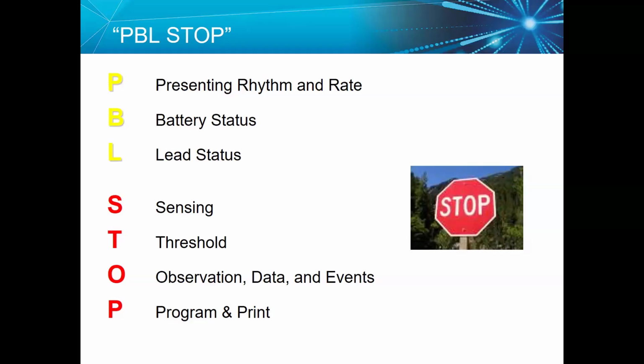This is the scheme for every patient who has a device: single-chamber ICD, single-chamber pacemaker, dual-chamber ICD or pacemaker, or CRT-D. We will go through this by a systematic approach.